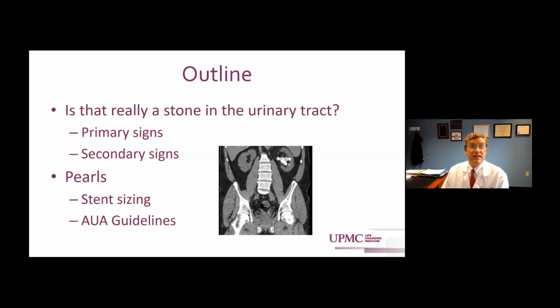With respect to, is that really a stone? We'll talk about primary signs, secondary signs, the pitfalls and the advantages of certain of those imaging modalities. And then a couple pearls just at the end if we have time. We'll talk about stent sizing, which everybody I think does differently, and I'll talk about some of the relevant AUA guidelines to this talk, because that's where many of the questions for in-service and qualifying exams for the boards all come from.